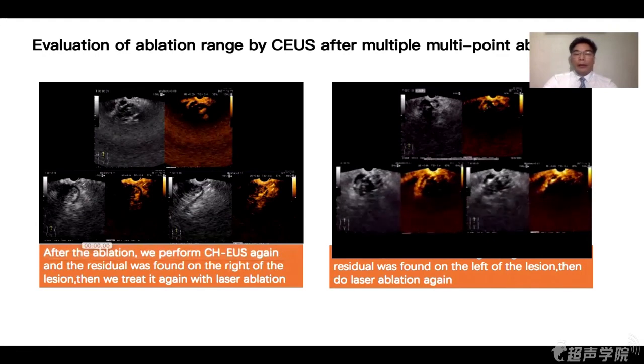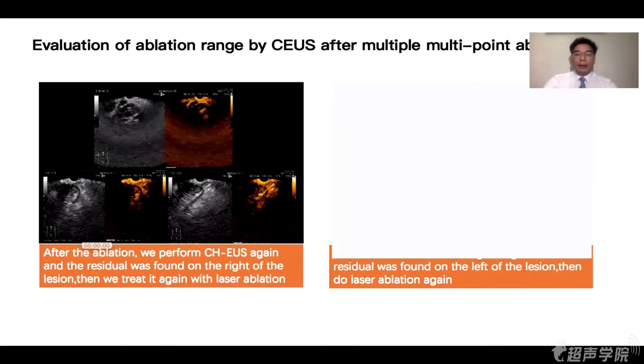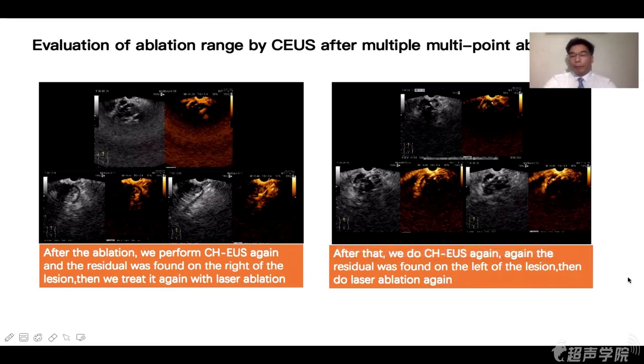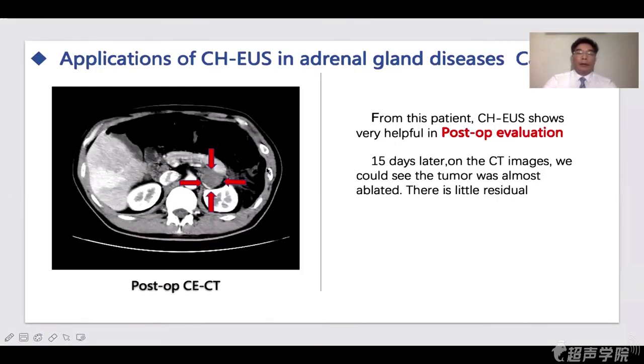After ablation again, we do another CHEUS. We showed residue again on the left of the lesion. Then we do laser ablation again. From this patient, we show CHEUS is very helpful in post-operation evaluation. After 15 days, on the CT images, we could see the tumor was almost ablated. There is little residue.